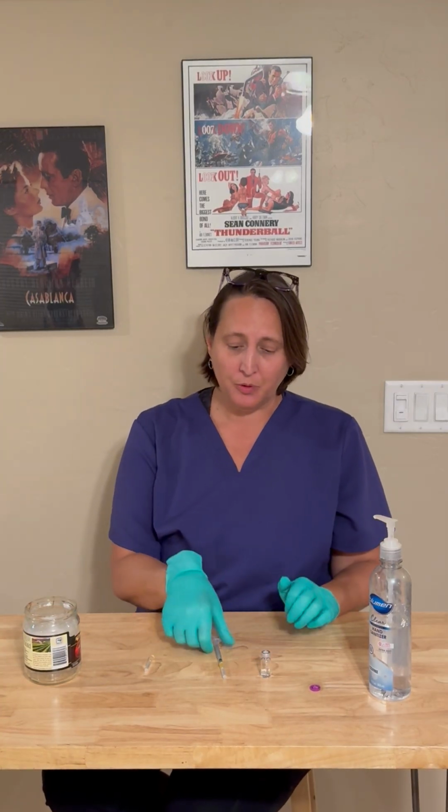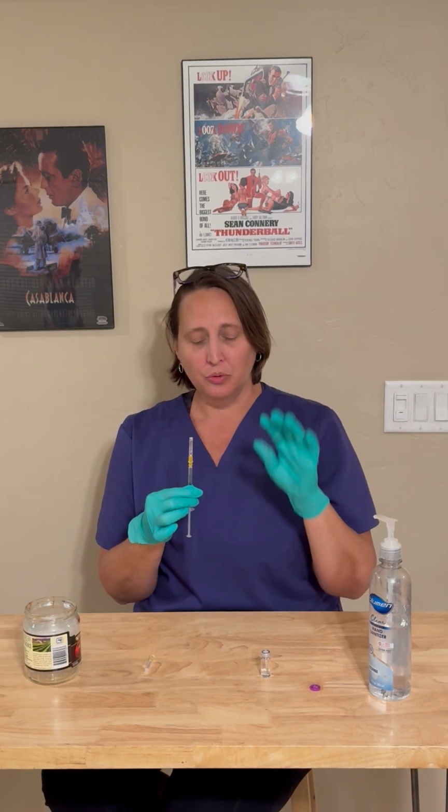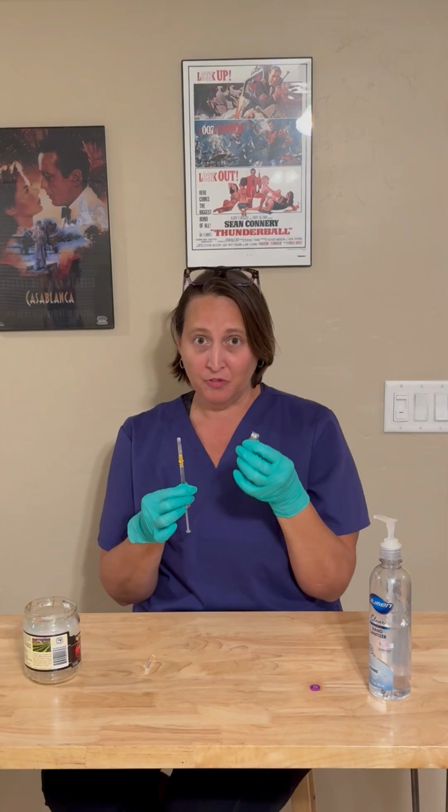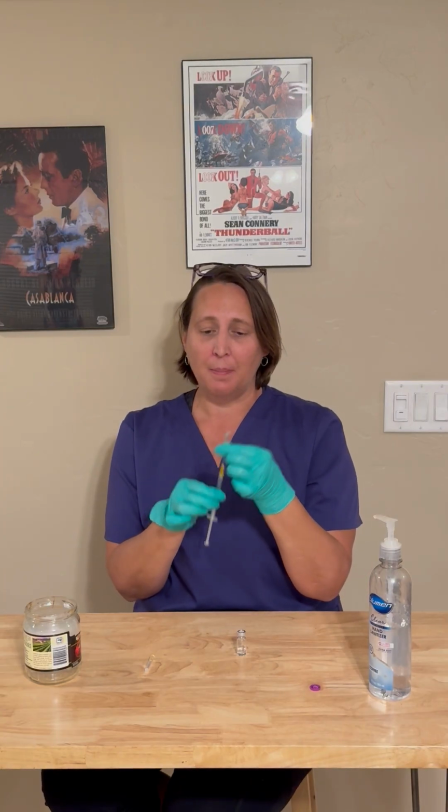While that's drying, we'll take our syringe with the needle that we've put on the top, and we're going to draw back some air into the syringe. Typically, we'll draw back an amount of air that equals the same volume of medication we're going to draw up. So 0.5. This air is very important to prevent a vacuum from being created inside of the bottle that prevents you from drawing the medication out of the vial. So the air is an important step in order to get the medication out. Go ahead and uncap your needle.